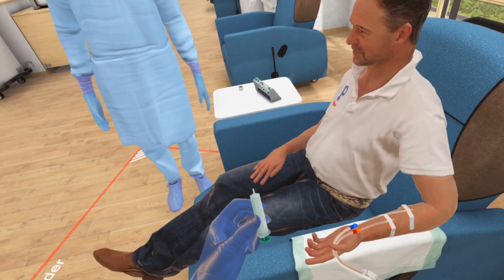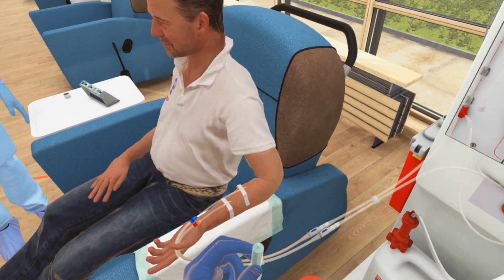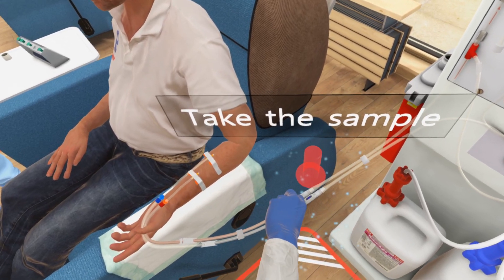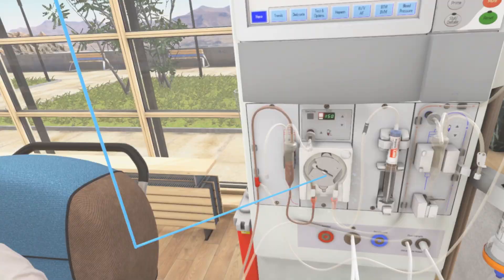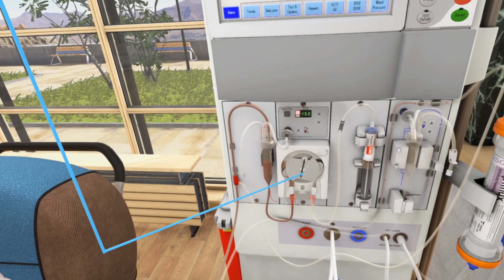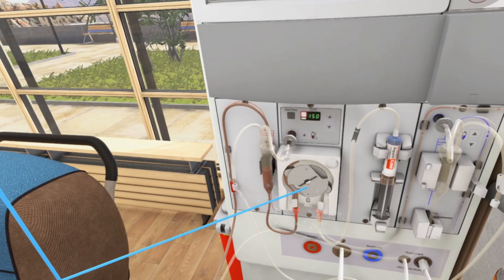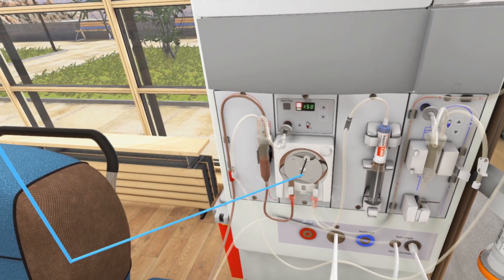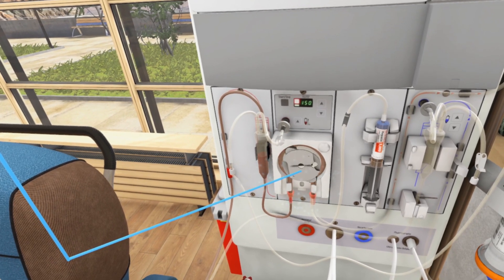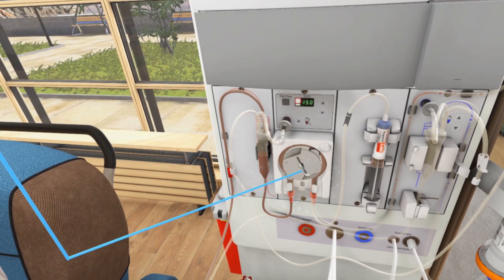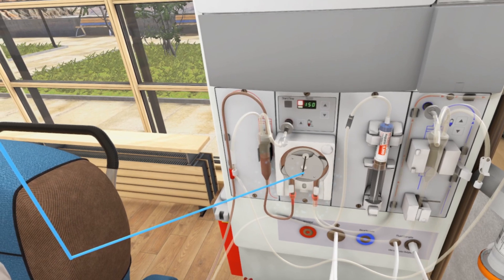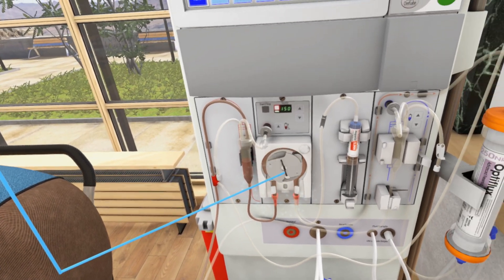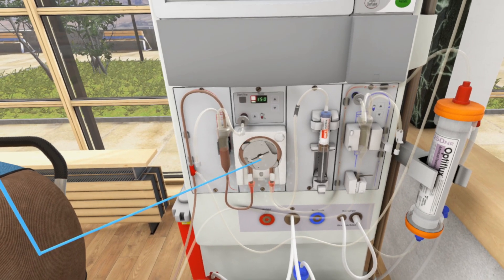Insert the needle-free tube into the sample port now. For blood to circulate continuously between the machine and the patient, a pump is required. It draws blood out from the patient through the arterial needle, pumps it to the dialyzer, and pushes it back to the patient in a closed circuit through the venous needle.